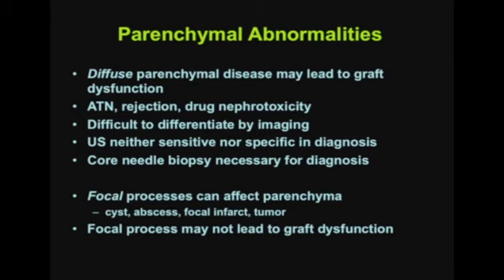Focal processes, of course, can affect the parenchyma of the graft, and there are many different things that can occur focally: cysts, an abscess, a focal infarct or tumor, and a focal process may not lead to graft dysfunction.